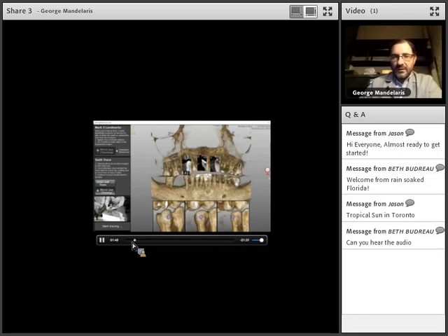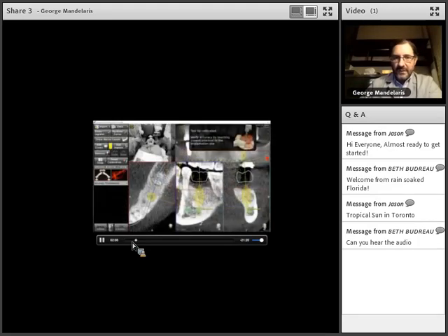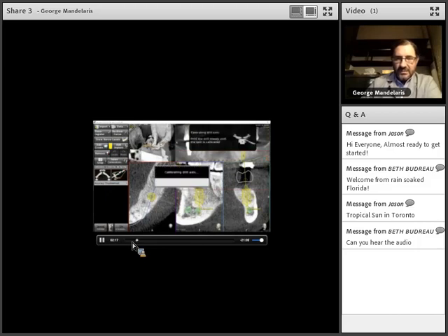The wonderful thing about these guys is that they're always making innovation. They're always changing. So if there's a better way to do it next week, we might be mapping 5 teeth if it's going to make a difference. So there's always innovation going on with Daron and everybody in Toronto. So that's awesome. So here we are. We finished the trace registration, and now Sylvia is going to go ahead and make sure that that is correct. She's calibrating her axis, her drill axis.